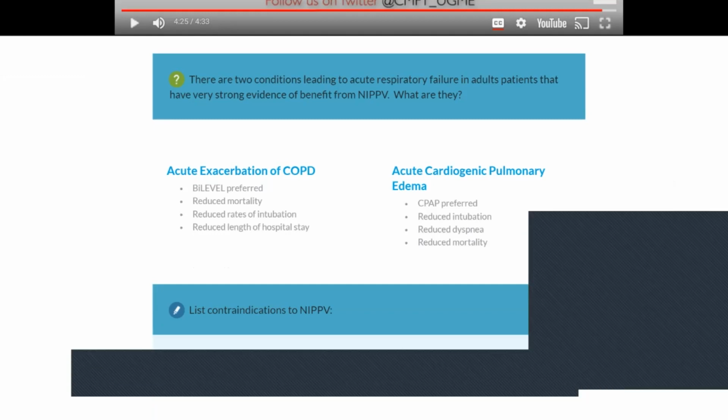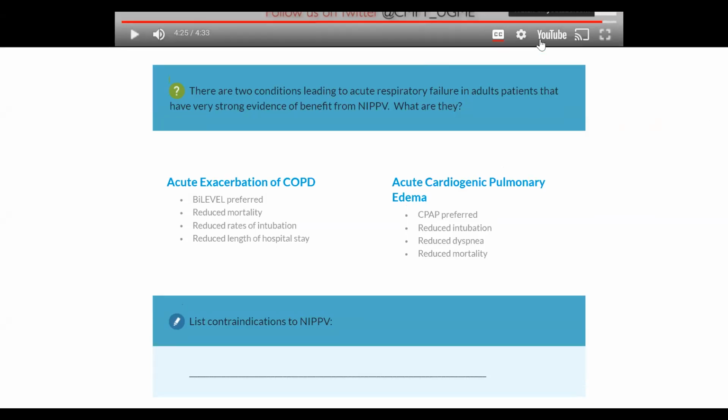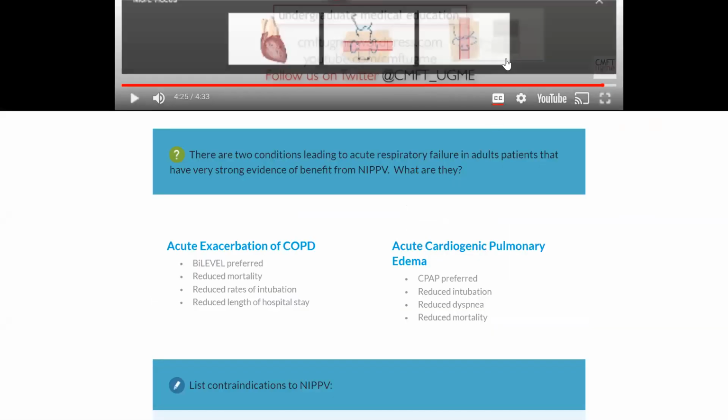So I like this video because it gives us a good summary of the difference between CPAP and BiPAP. And also we can keep in mind the high flow oxygen therapy we have discussed before, so we can see what is added with this. So you remember that now we have inspiratory pressure, which will push more oxygen with each breath. That will minimize the effort of the patient, and also it can help with ventilation to remove retained CO2.